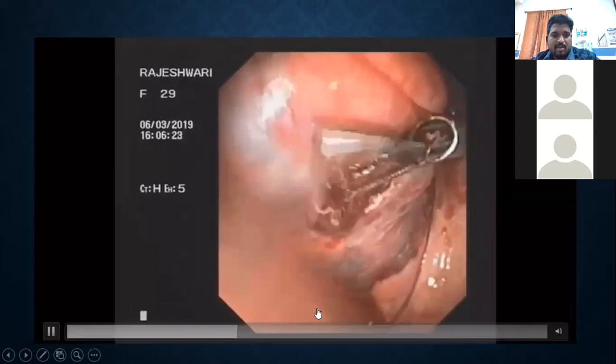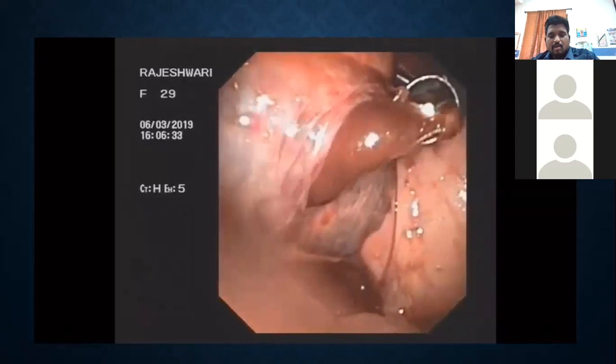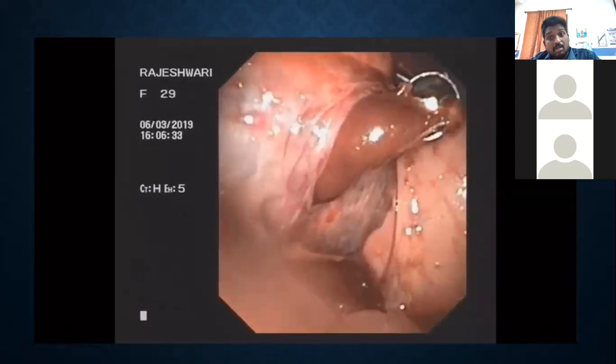This is somewhat different. That's why, actually, in Birt-Hogg-Dubé syndrome, pneumothorax is not quite as common as in LAM. So Birt-Hogg-Dubé syndrome can present with a cyst, but pneumothorax is definitely much more common in LAM compared to Birt-Hogg-Dubé because of the texture of the cyst. And then you could see the content of the cyst is a very gelatinous liquid. Obviously we think the content should be air, but here you see the cyst content. What we did is, with the instrument, we cut the cyst wall and then we break it out.